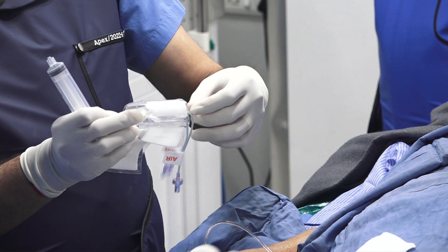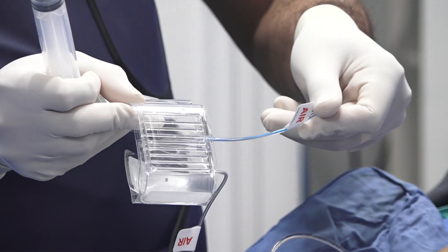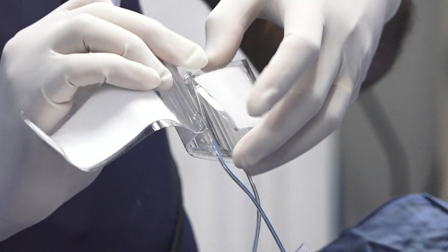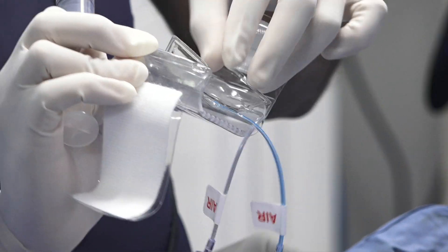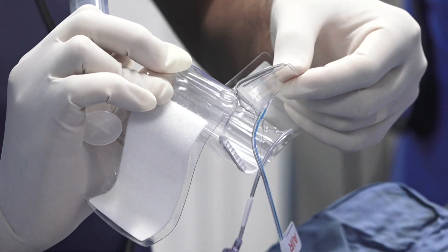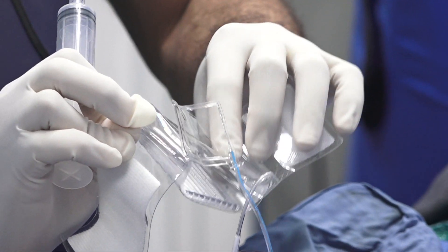The two balloons have tubings of different colors. One is blue, as you can see here, and the other one is clear. The radial balloon is the longer balloon, as you can see, and the ulnar balloon is the shorter balloon. The ulnar balloon goes forward like this, and the radial balloon is attached in a way that it compresses in a different direction.